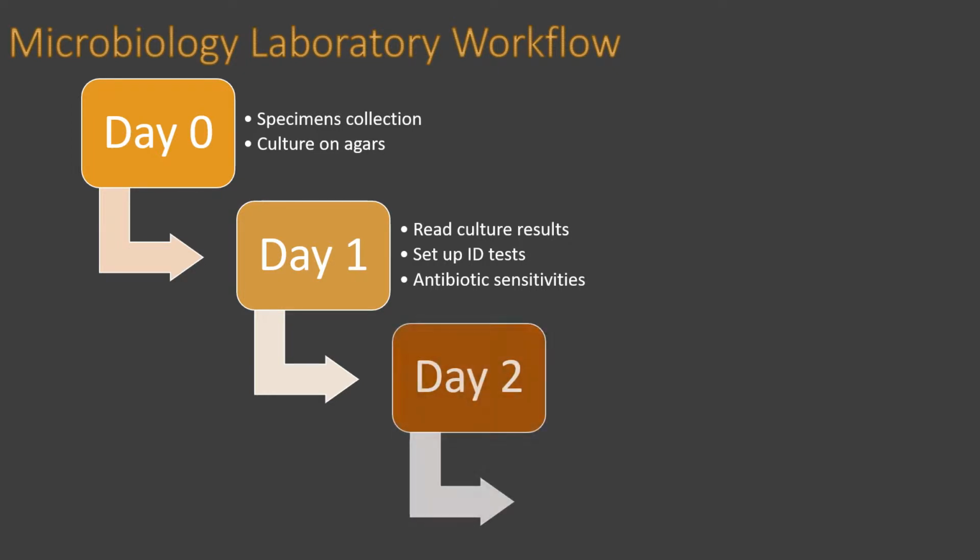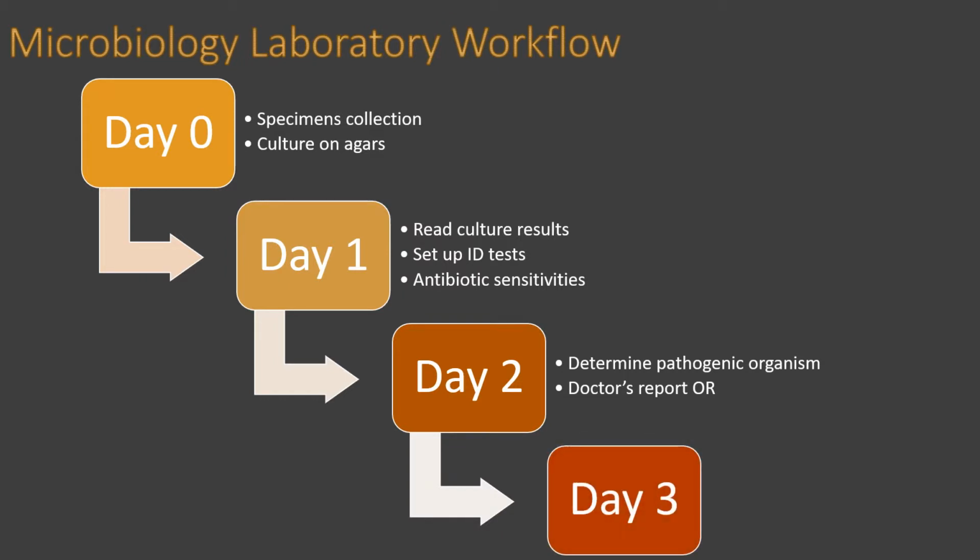On day 2, we might be able to determine the pathogenic bacteria from the extra tests and write a doctor's report, while often in cases we would need to do more tests to identify the cause.